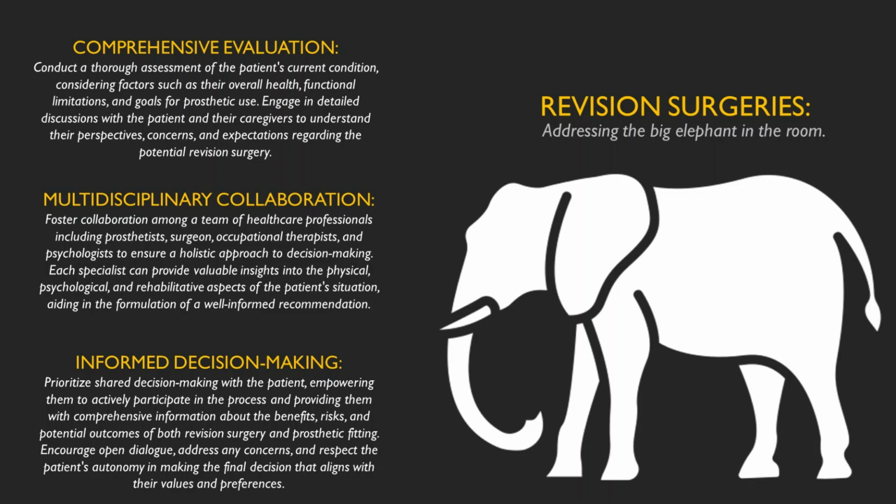All right. And then the last chapter, I'll let either of you decide to jump in on this, but talking about that big elephant in the room. Go ahead, Mike. Going through the evaluation process and evaluating what's available for patients based on how they present, it can be challenging if the amputation site or level isn't ideal. In some cases, it's rare, I'd say it's not something that we run into often, but in some cases, a revision surgery is ideal or needed, in our opinion, to be able to fit that patient with a device that's going to give them the best outcome.